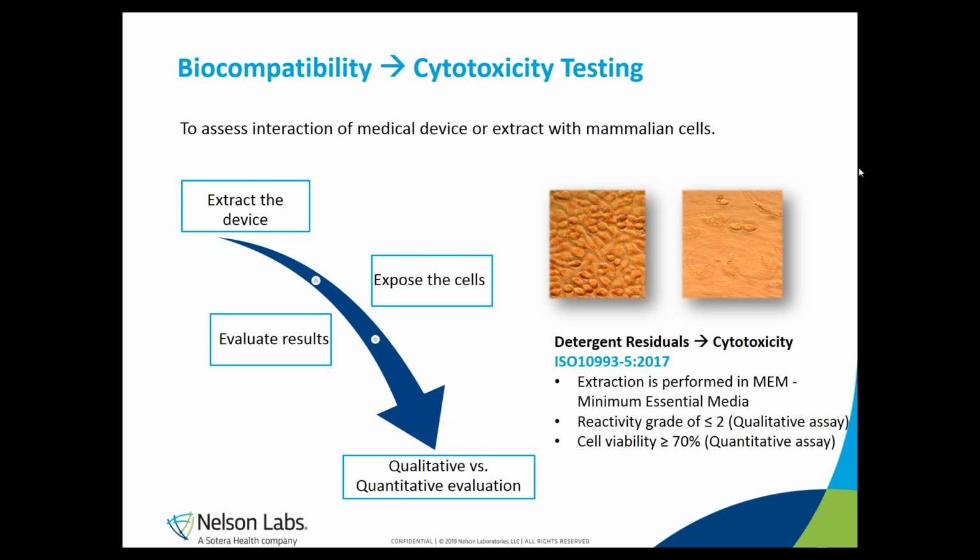Our cells are exposed to the extract of the device and subsequently, after appropriate incubation, scored for their viability. This can be done with qualitative or quantitative methods. Anyway, a device should pass the cytotoxicity assay after processing. In case a failure is detected, additional rinsing steps may need to be included in the cleaning or disinfection procedure to get rid of any remains of chemicals.